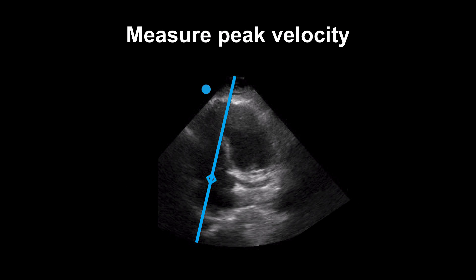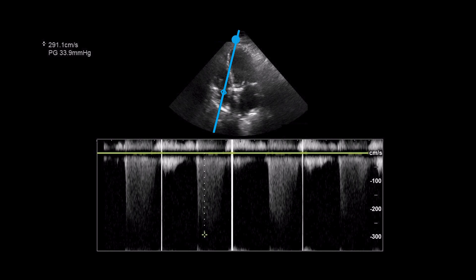Then we need to measure the peak velocity of this jet. To do this, we need to activate the continuous wave Doppler to measure the peak velocity of the regurgitant jet. We place the continuous wave Doppler at the site of the regurgitant jet, and we'll obtain a tracing such as you see here. The peaks that we see here correspond to the regurgitant jets coming back across the tricuspid valve.